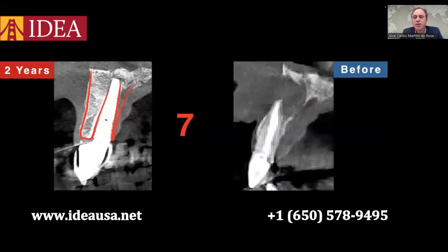We are not talking about magic. We are talking about biology. And the bone graft that was placed above the head of the implant remodeled above the head of the implant. That's the main difference between the IDR technique and the other techniques available in the literature.